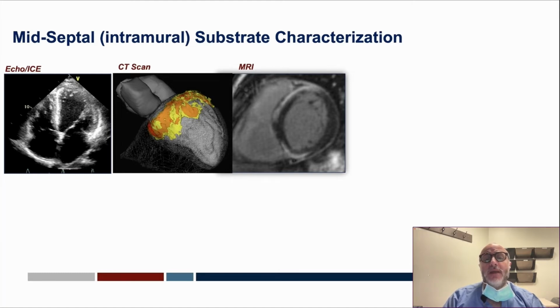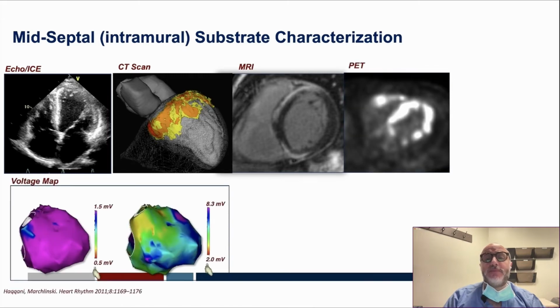Cardiac MRI is also very helpful, and you start to see how there is an endocardial portion that could be layered as more healthy tissue, and then intramural delayed enhancement. A classic image of cardiac sarcoid, predominantly intraseptal in this patient, very diffuse, but you can see the inflammation in cases of intramural arrhythmias. In the EP lab, characteristically, we have described the frequently normal endocardium, and you can see here the correlation in voltage map with the MRI.